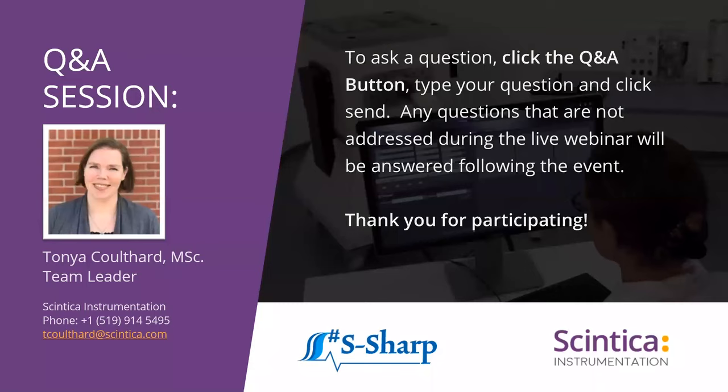When the heart rate goes above 500 or 550 beats per minute on a mouse, those 2 things are happening almost simultaneously, and being able to resolve the E and the A peak becomes exceptionally difficult. There's not a lot that can be done in terms of the heart rate, because you do want to make sure that the heart is functioning as close to physiological as possible. But again, it doesn't have to do with the resolution of the probe.